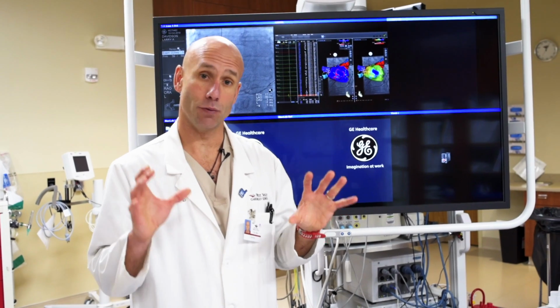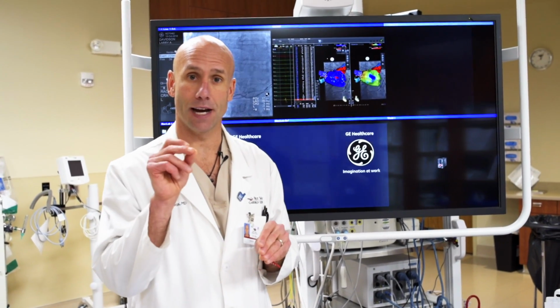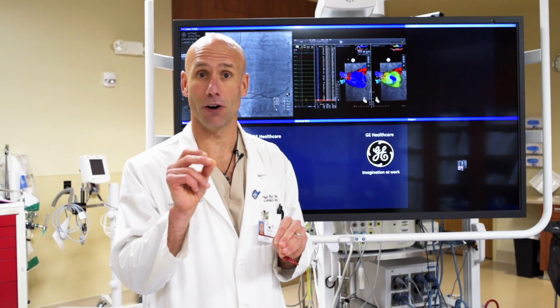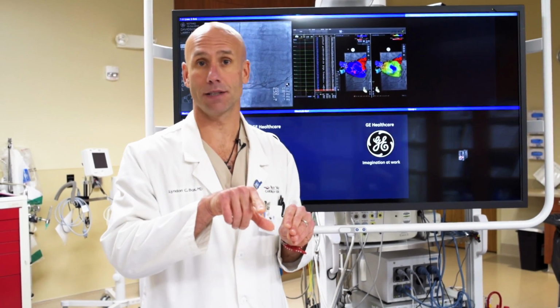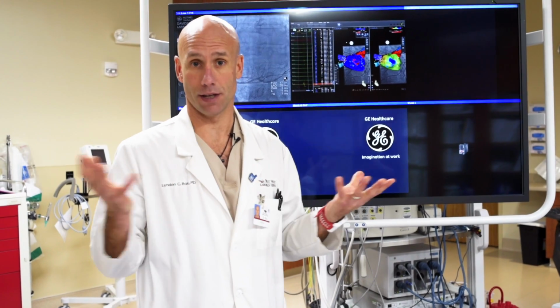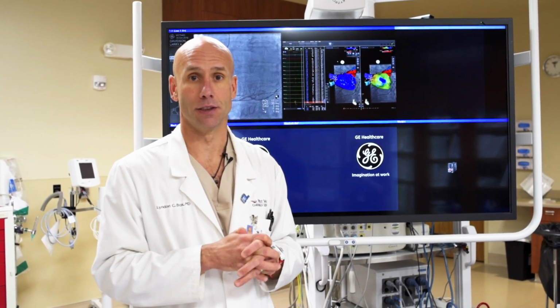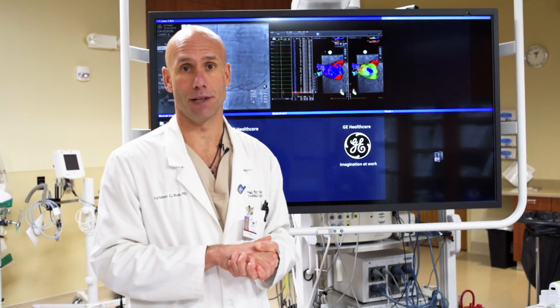Once we've done that, if we do find that somebody's had a blockage, through that catheter we advance a very tiny wire. The wire is actually like a thick hair almost. We can advance that into the artery past where the blockage is, and then over that wire insert a device that I described earlier, a stent, which allows us to open up the blockage, immediately sometimes relieving the chest pain or symptoms that patients are having.